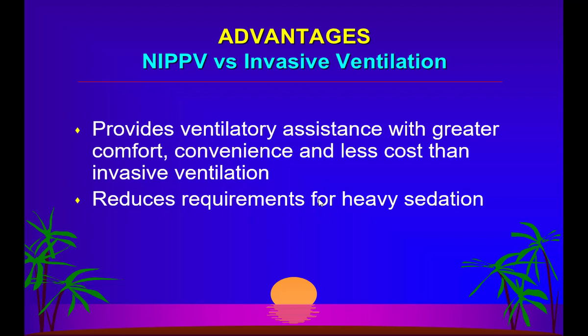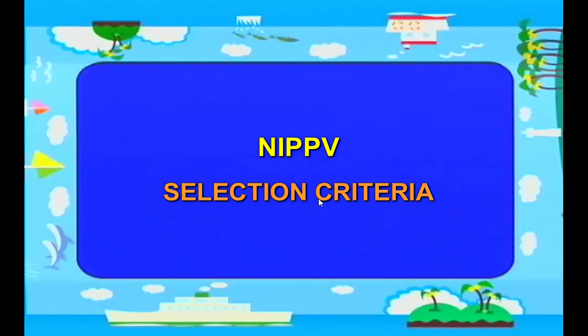You have to be on the edge. You have to be seeing this patient very regularly. You can't leave these patients at the mercy of the sister. Like if you intubate the patient, you're pretty well, right, sister taking care of everything, but with non-invasive ventilation you have to be very, very careful. So as I said, invasive ventilation is sister-oriented, but non-invasive ventilation is doctor-oriented. With a lot of decisions you have to make which the sisters cannot make at the bedside.